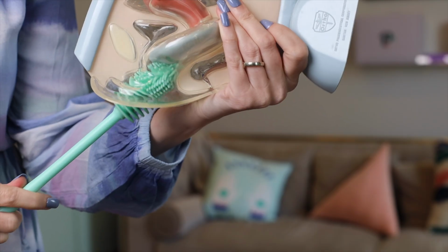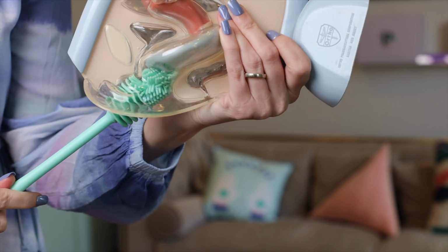Flat fit. Flat fit is a pro because if you're someone with a lower cervix, or if you want to have penetrative intercourse on your period and you don't want to deal with messy sheets, and let's be honest, it's maybe not about not touching blood and more about not doing laundry. So a flat fit means that there's room for activities, and that's the best way to say that.